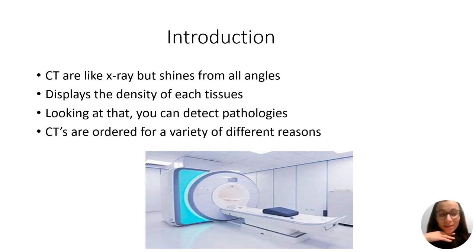So where does the CT come into that? CT is an X-ray. It's a rotating X-ray machine that takes multiple images from different angles of the body. Those images are then processed by the computer, and it creates cross-sectional slices of the body. If you think about it, you have a 3D image as opposed to just a picture.